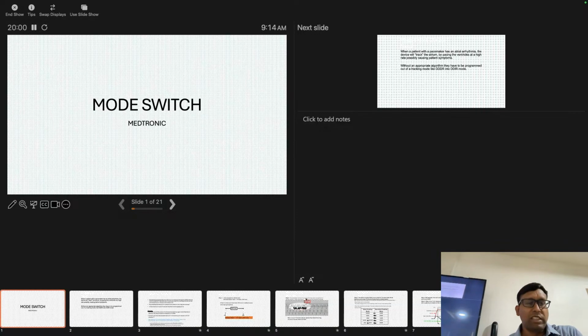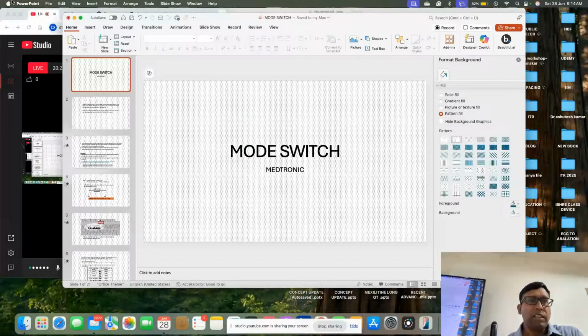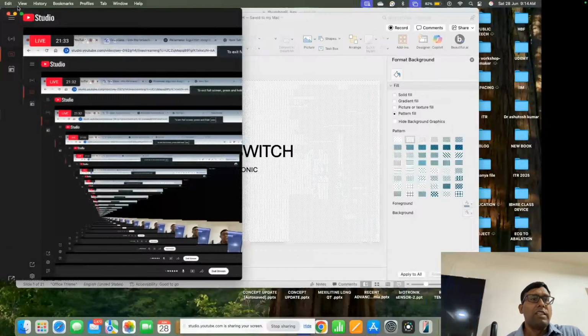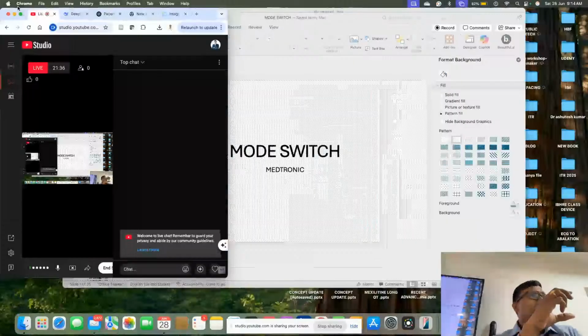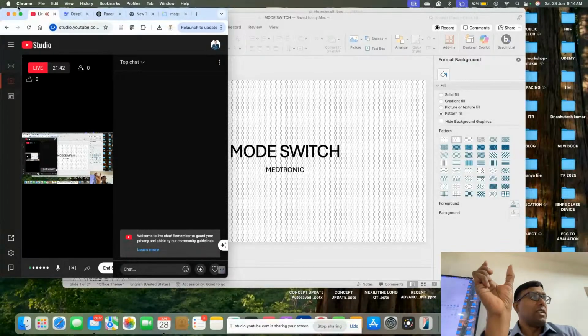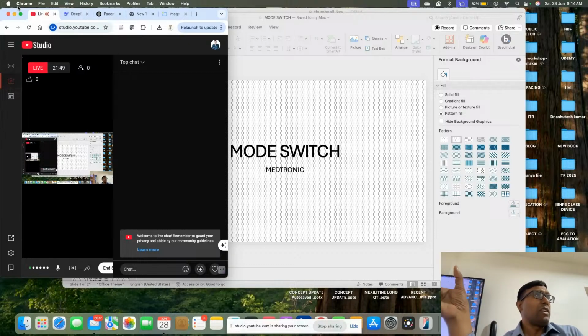If the patient has good sinus function, in that situation we don't want the pacemaker to utilize pacing. So sinus rate is there. We have set that, okay, at 70 rate, till the 70 rate is there, the sinus rate should be tracked down to the ventricle. That is called tracking mode.